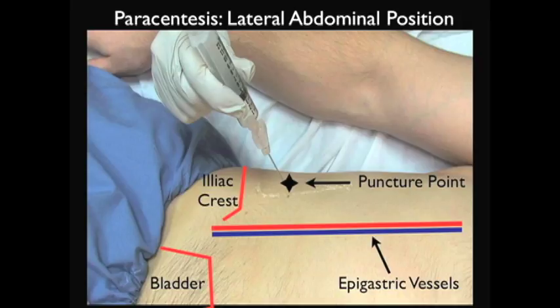Using ultrasound guidance, we can map out the best position on the abdominal wall for the paracentesis approach and go either right or left side depending on the maximal pocket of ascites present. We also want to ascertain the relative locations of the liver and spleen so as to avoid iatrogenic injury to a solid organ. And as we emphasized earlier in the video clips, we want to look for that intestine with anchoring mesentery so as to avoid intestinal puncture during the procedure.